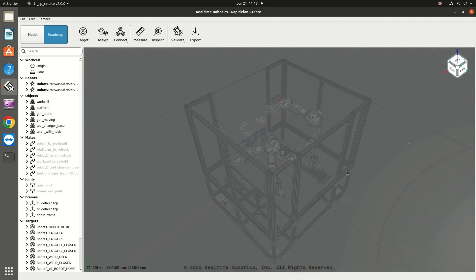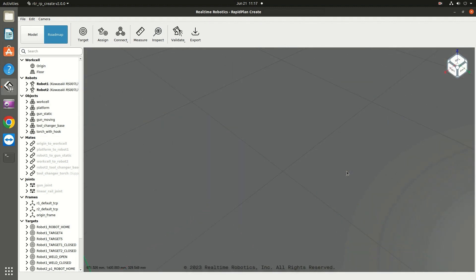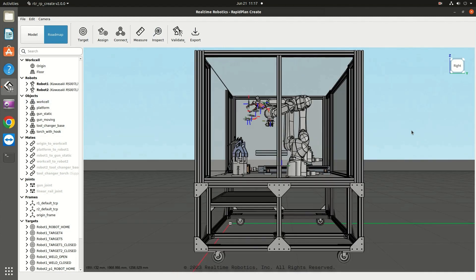If you ever lose your place so that no parts of the work cell are visible and the 3D view shows only an empty environment, click on the cube. It will snap you to a complete view of the cell.